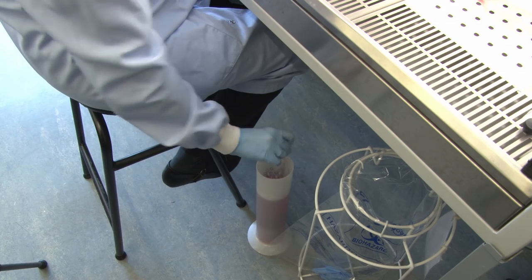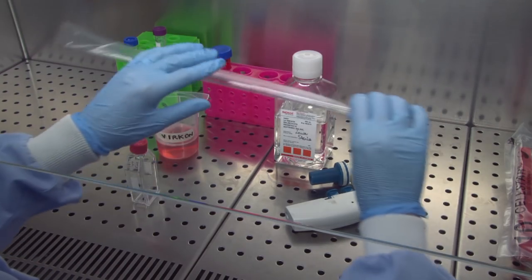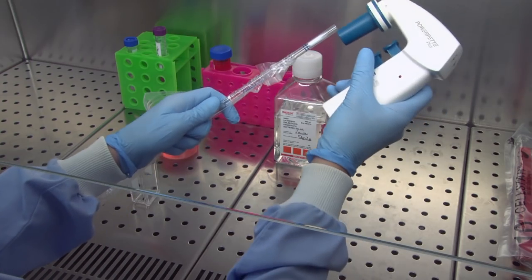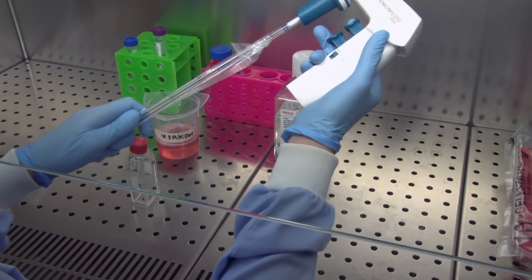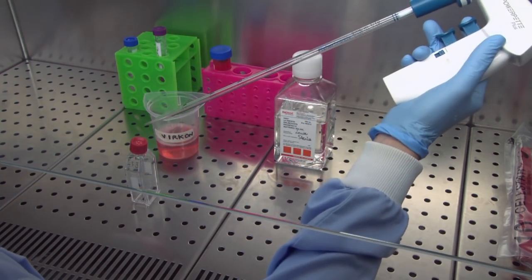The next step uses a molecule called trypsin, the digestive enzyme that's found in all mammals. It's used to disrupt the proteins which stick the cells to the plastic flask.